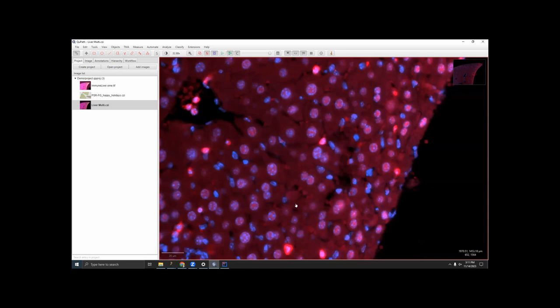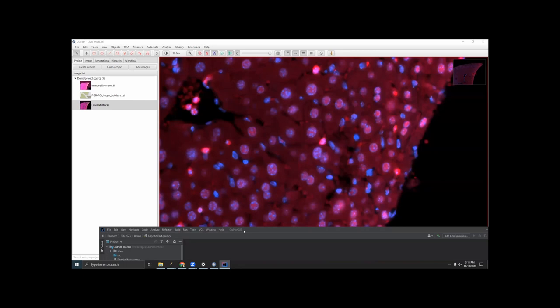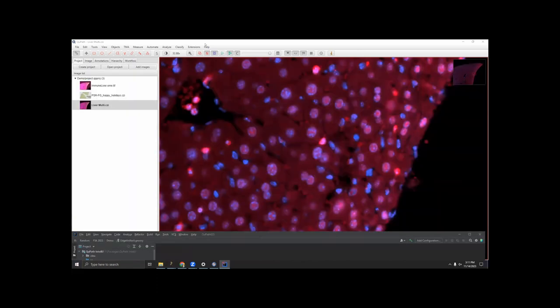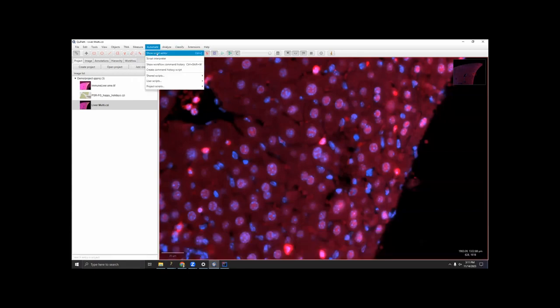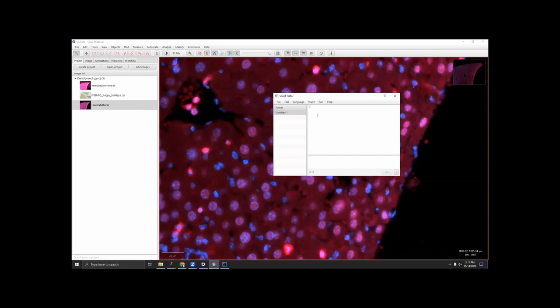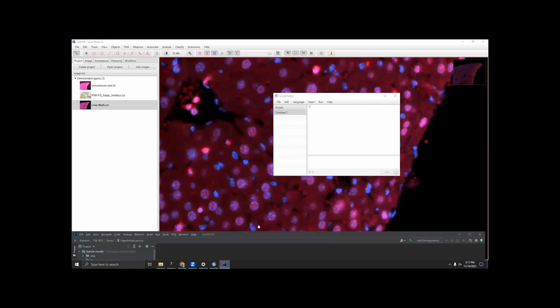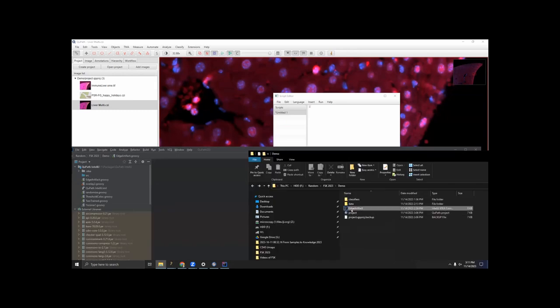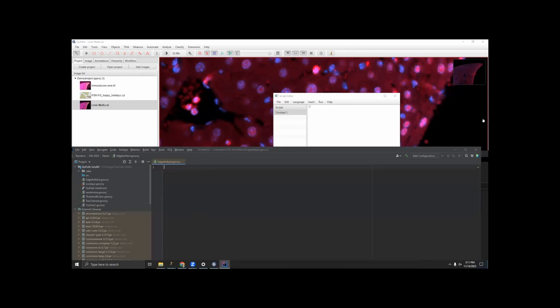I actually like to do scripting for QuPath in IntelliJ. There are resources online in the QuPath Read the Docs on how to set up IntelliJ such that it can access the QuPath source code. If you don't want to go through that process, everything I'm showing here can absolutely be done through the QuPath script editor. It's just a little less convenient, and the script editor doesn't do things like color code and point out mistakes and debug for you. So I'm going to drag a blank text file called edge artifacts into IntelliJ. Right now, there's nothing in it.